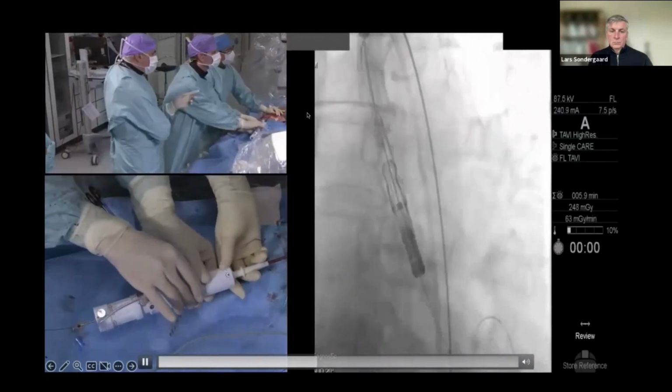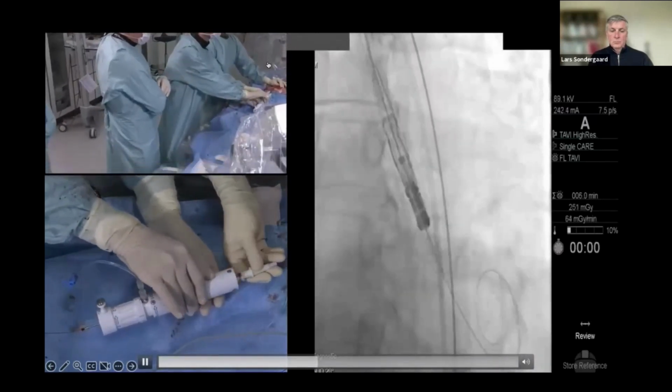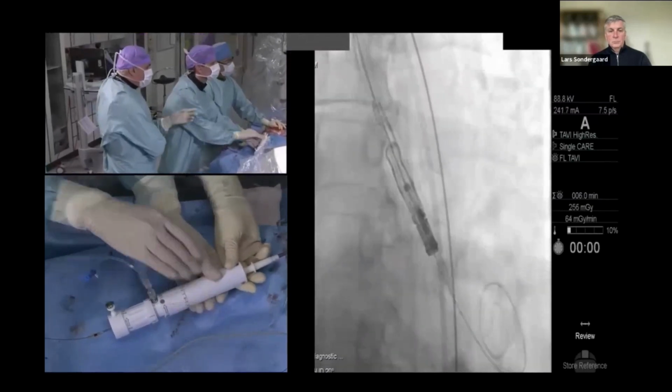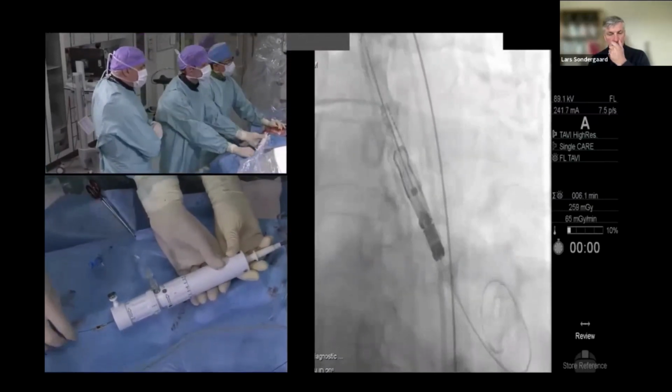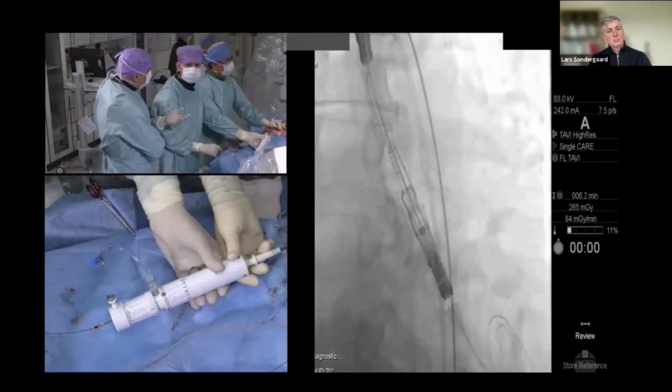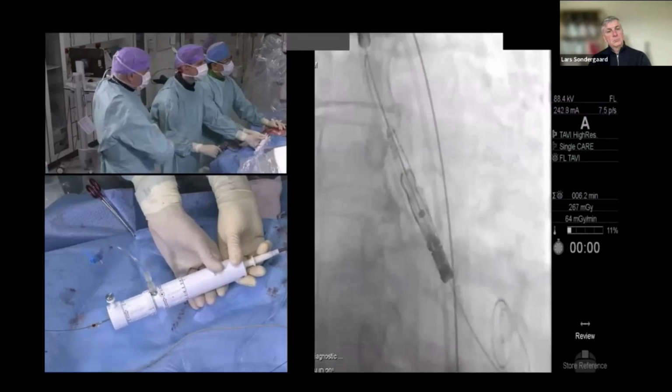But yeah, maybe just seeing while you rotate, just to illustrate how it may be easy to look at the top part, that now it looks like those. And how much are you rotating, Ole? Yeah, this was actually less than normal because we need very little. I would say 90 degrees, sometimes you go even up to 180 degrees or even 360.